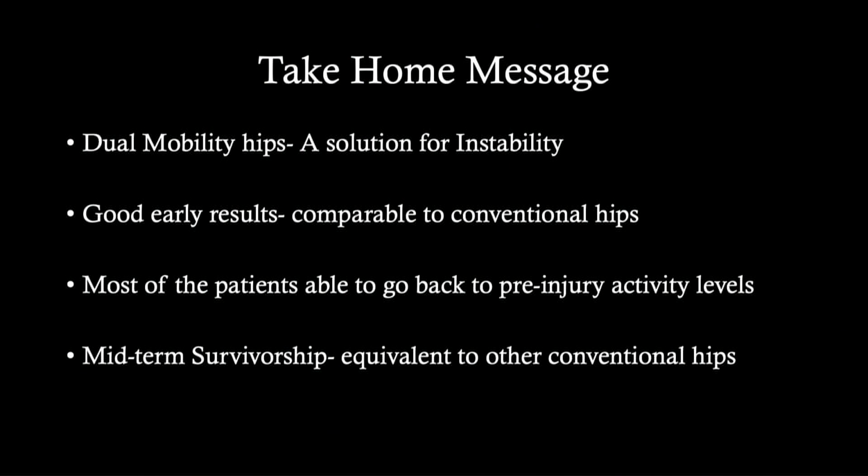To conclude, my friends, dual mobility hip is a good solution for instability. It gives good early results which are comparable and may be better than conventional hips. In our study, we have seen that most of the patients were able to go back to their pre-injury activity levels, and mid-term survivorship is equivalent to conventional hips.